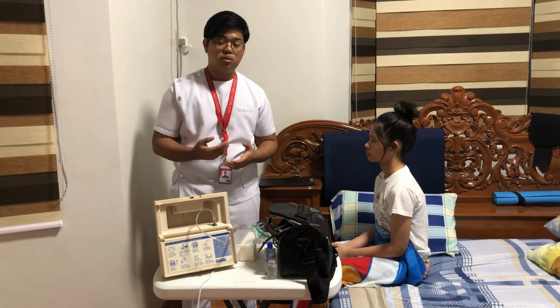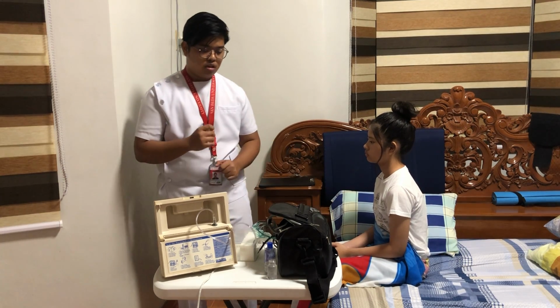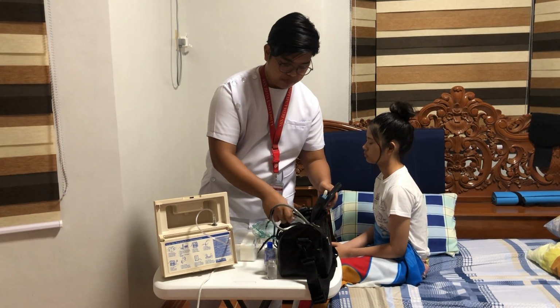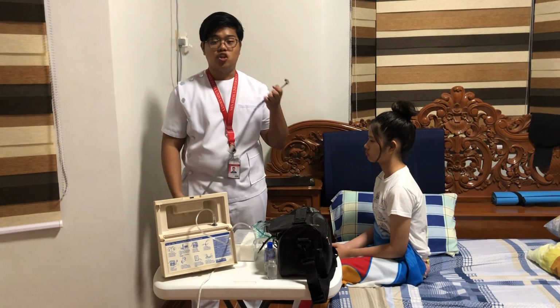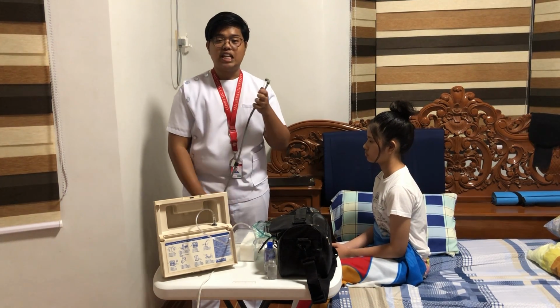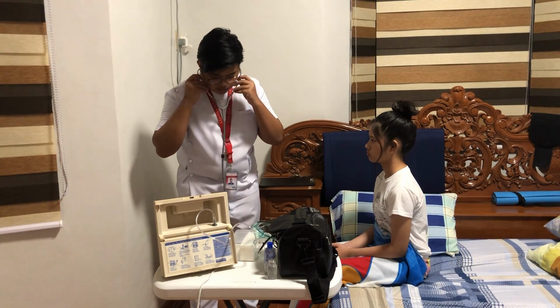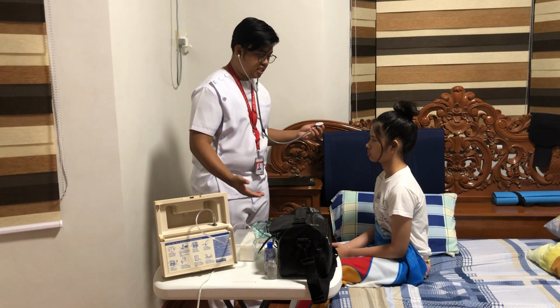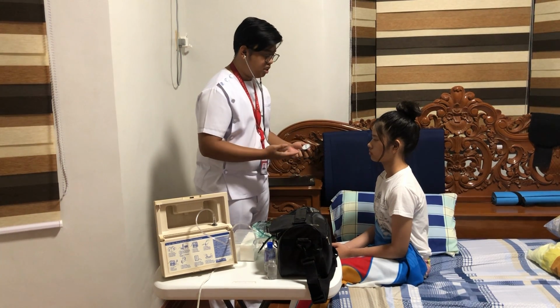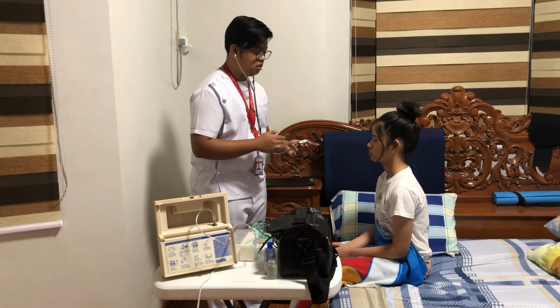The next thing that we need to do is to take the patient's vital signs, and again, we need to assess the lung sounds in order to detect any adverse reactions towards the medication that we have just administered through the nebulizer. So ma'am, now that your nebulization is done, I'm going to assess again your breathing patterns and breathing sounds through auscultation.